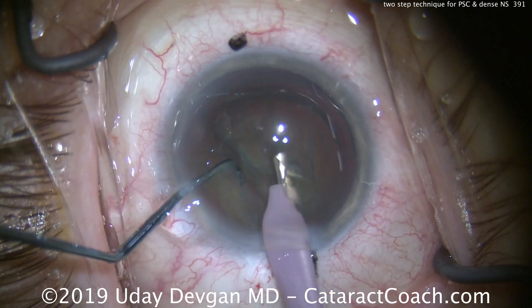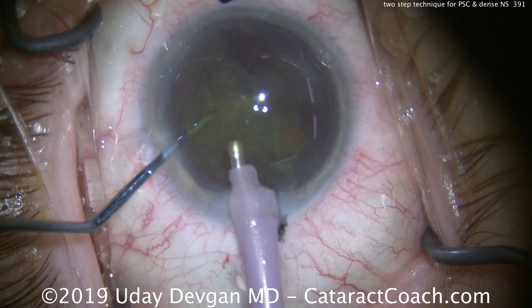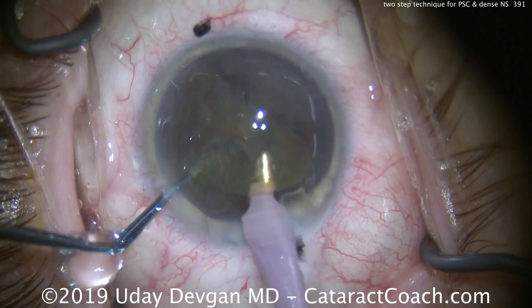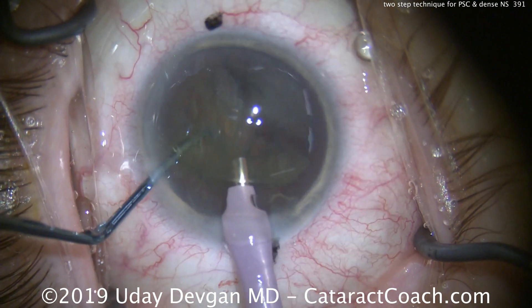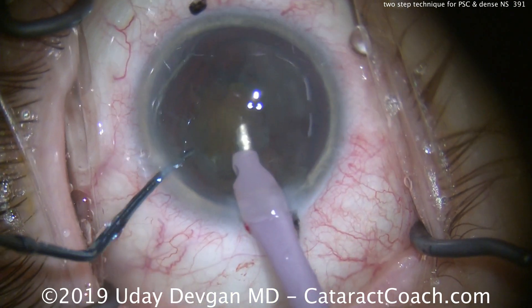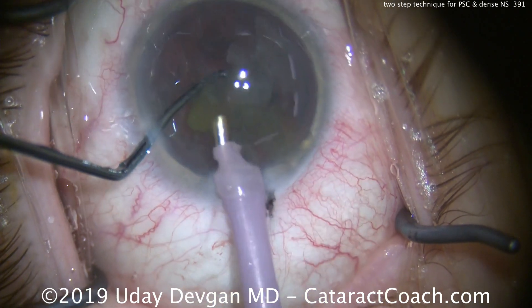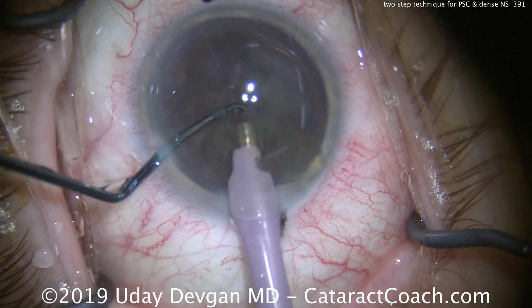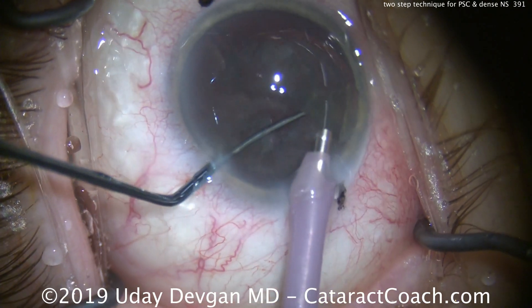Now we can wolf down each half. We use the chopper to bring that half in front of the probe. We're using phaco power modulations to totally minimize the amount of energy we put in the eye, staying centrally to emulsify the first half. Once the first heminucleus is out, we get to the second — buzzing in, using the phaco chopper to feed pieces towards the tip. This was the dense nuclear sclerotic part; it's just about gone, one last little piece remaining.